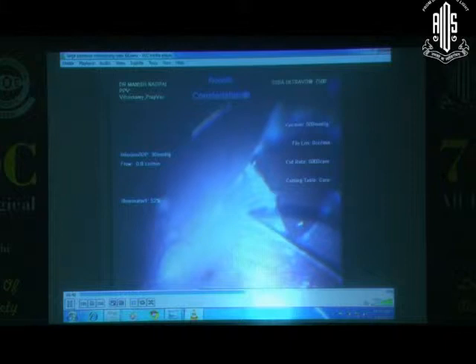At this stage I've filled up with PFCL just to make sure there's no spillover bleeding which goes to the central area, and I've got better control. It's like a third hand which gives weight to that particular area. Then I undertake a radial retinectomy here, because I feel that by relaxing a little bit of this radial component I may be able to further relax those folds which are radiating just over the macular area.